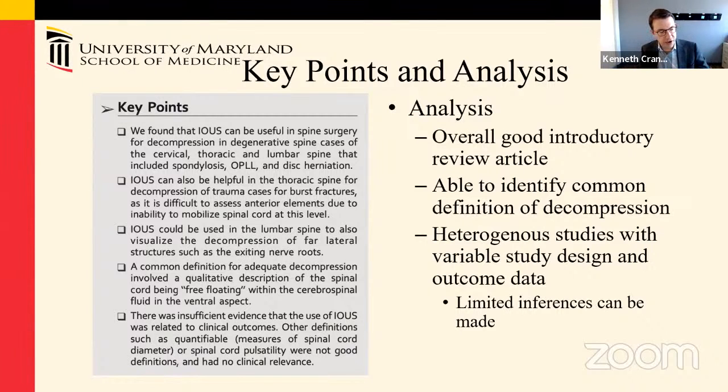But that was an idea that I had. They do sell very small probes made for pituitary surgery, but we don't have them at our institution. I'd be curious to see if a probe like that could be placed into an ACDF discectomy, or potentially even a microdisc like I was talking about.